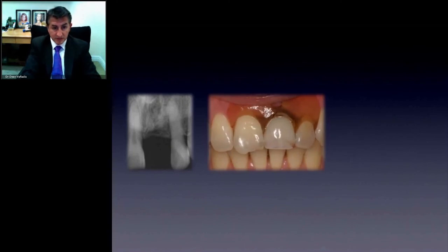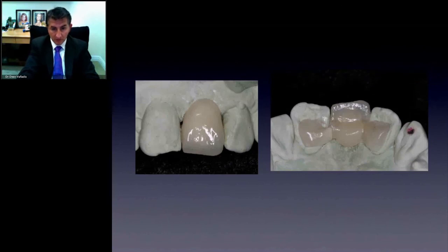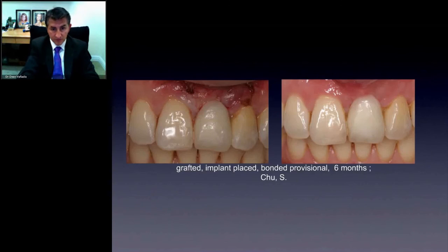Let's go to the anterior restoration where we're going to plan our abutments. And this is what we're doing today. The patient presented with a removable restoration. We have to do some soft tissue grafting, so we're going to fabricate an Emax bonded bridge. That's our protocol today, a bonded bridge for anteriors.